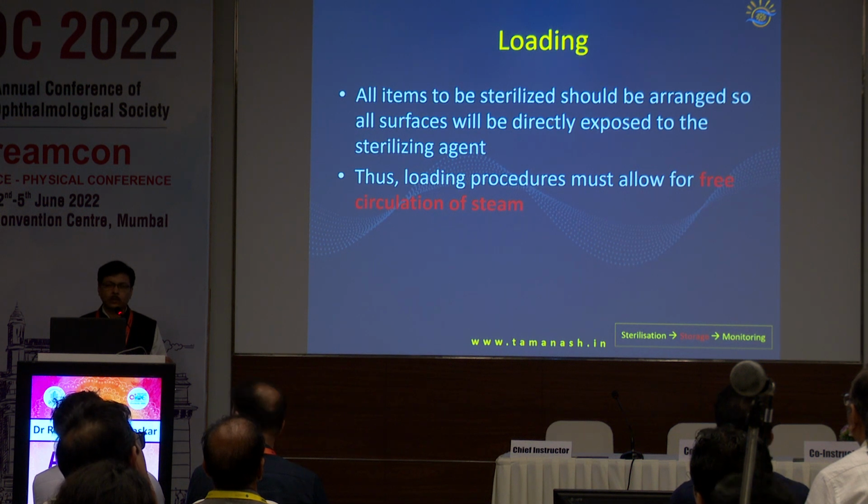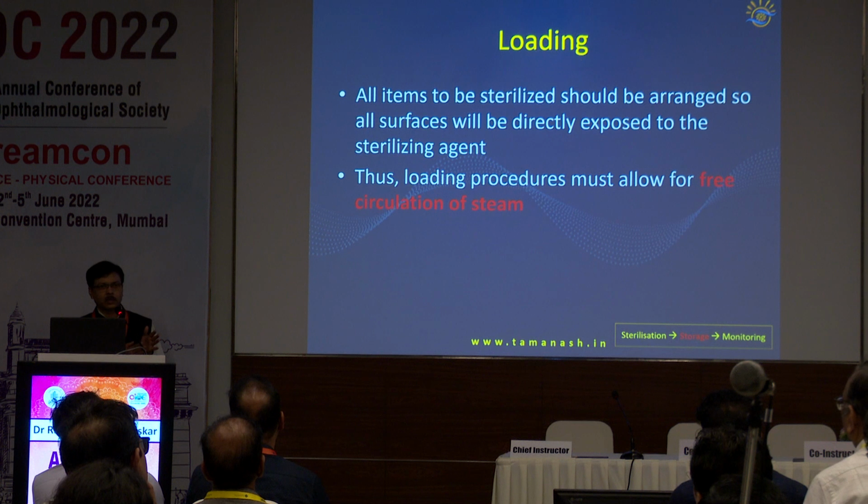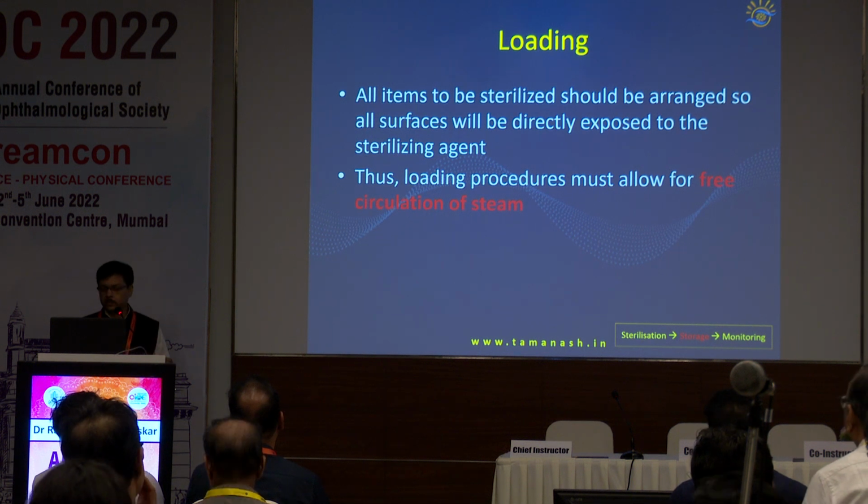So when you are loading the autoclave, it is very important to load it in such a way that the steam can percolate and enter through. If you are stacking them very tightly, then the steam will not enter the interfaces. So it is very important to stack them loosely.